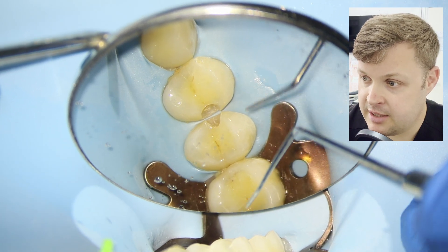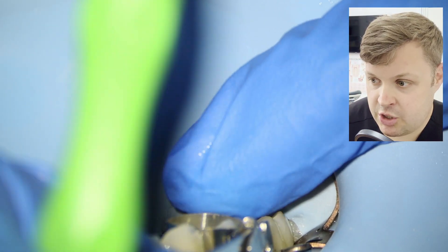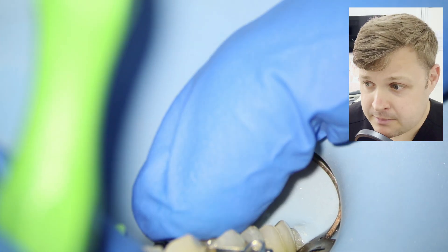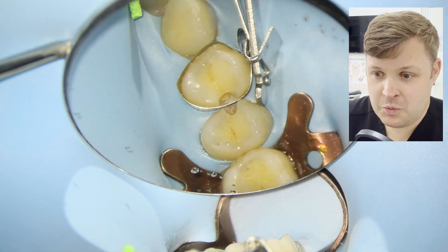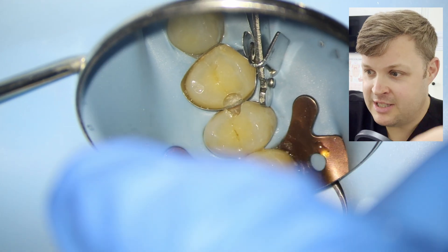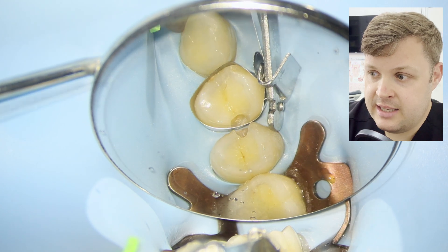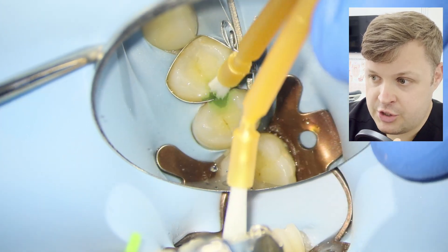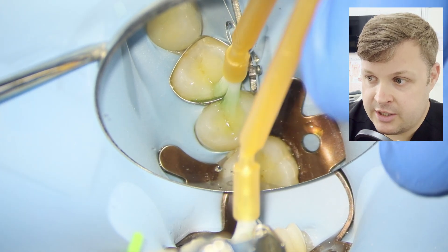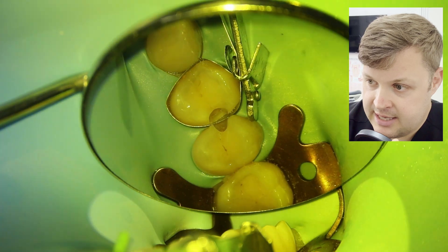You can see I've broken the contact point there. The first matrix I'm going to use is just a normal matrix band. I could use two sectional matrices — Garrison or Paladent — but in this case I found it easier to create the first surface with a matrix band. It's less fiddly and less to go wrong.